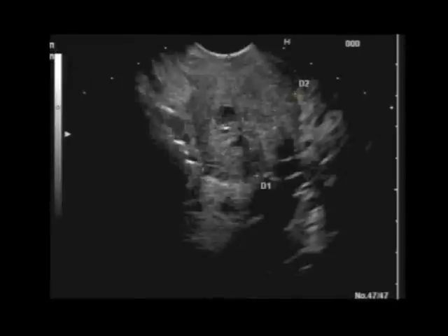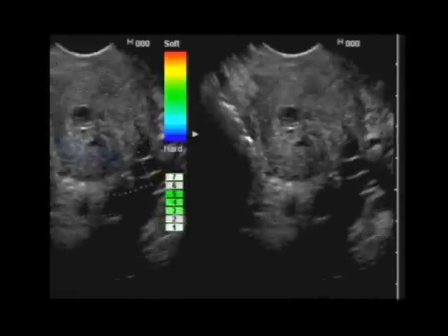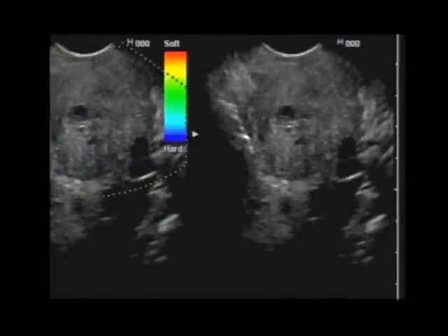Maybe I'll just change the sample. Here you see this lesion here. Now this is not so bad — it's a nice image. It's a huge lesion, 4 cm. If you use the elastography, I think we'll see a very hard lesion.